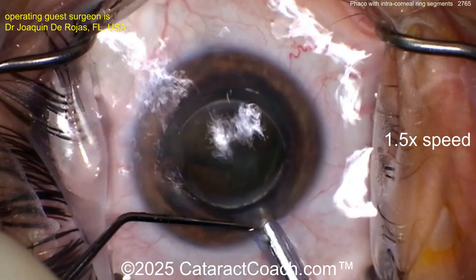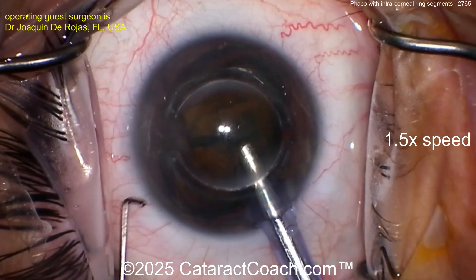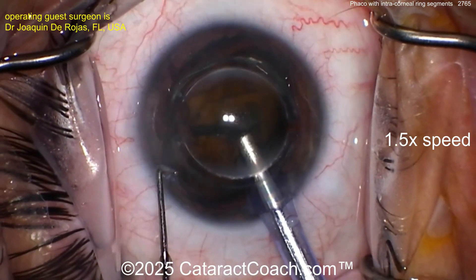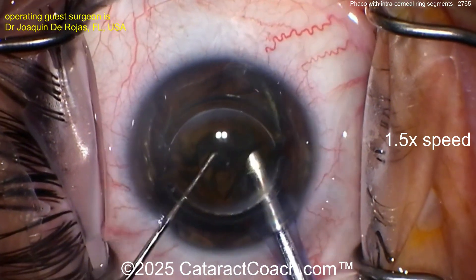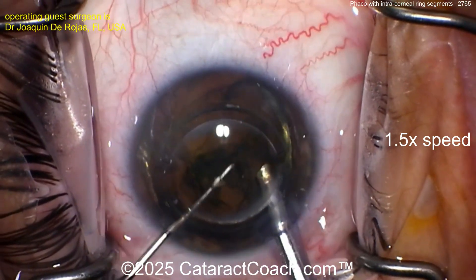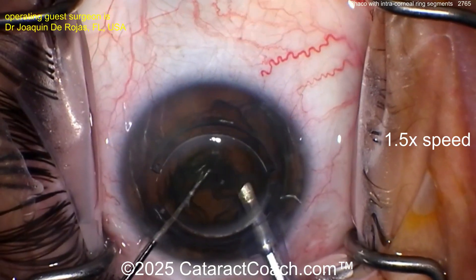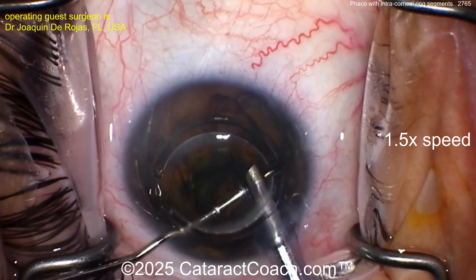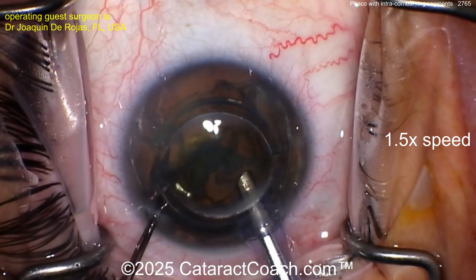The original use of ring segments was to treat lower degrees of myopia by causing central corneal flattening. Those patients have had them in for a very long time — very stable — so the decision was made to just leave the corneal ring segments in place. They've been there for 20 years; let's leave them alone.